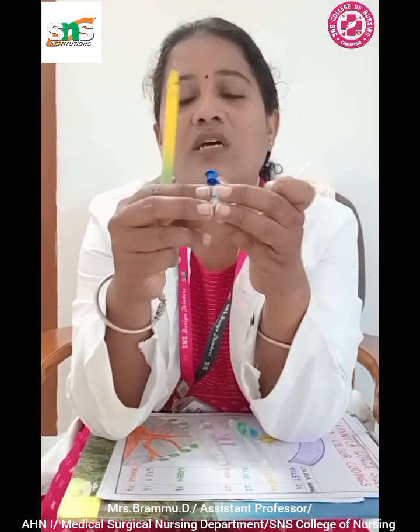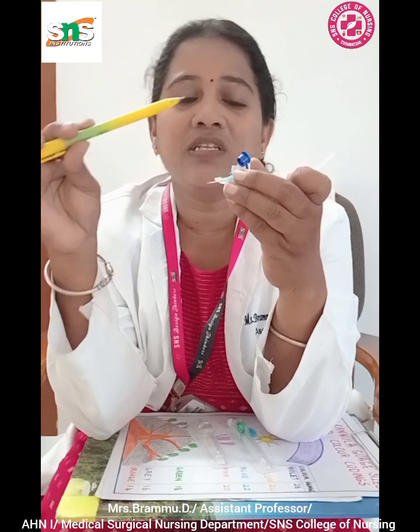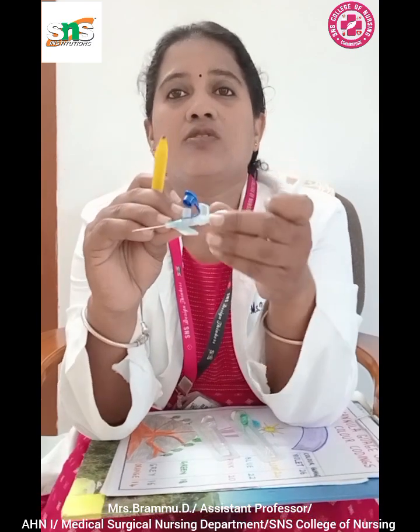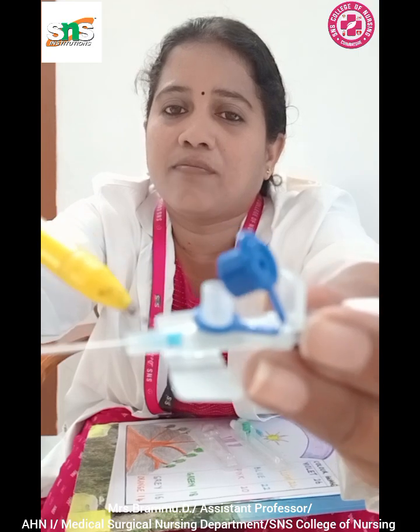Next, I would be explaining the bushing. The bushing is reinforcing the connection between the catheter and the hub and ensuring structural integrity, and it is preventing leaks from the IV line into the patient. So the bushing is reinforcing the connection between the catheter and the hub. Okay, that is the bushing.